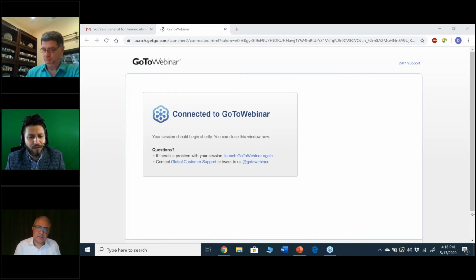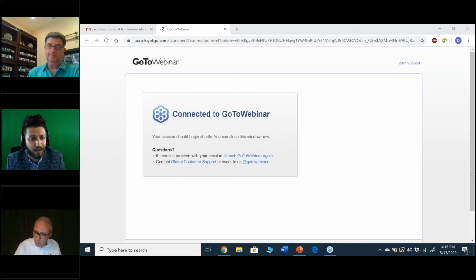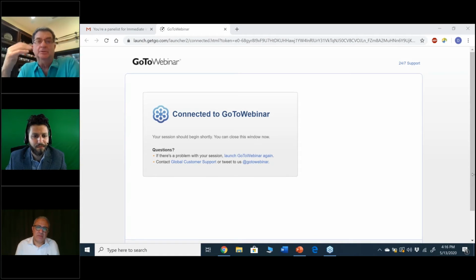Perfect. We're going to move on to the next question from Dr. Fernan, who is asking Dr. Tarnow about the dual zone bone grafting. In the case where you did use a xenograft, why did you not remove the particles left in the sulcus? After 6 years follow-up, the outcome was more than decent, even though the particles were left there. I didn't want to take them out because it would create a void and they get collapsed in. So I let them heal. It was a thick enough tissue where it was coming out the sulcus slowly, like little particles over the year. So I just let them come out naturally.